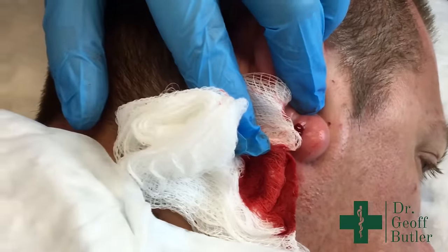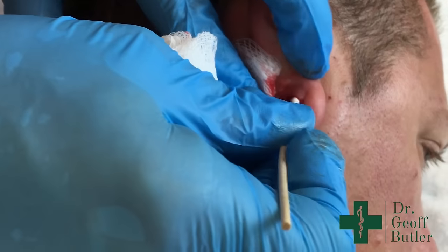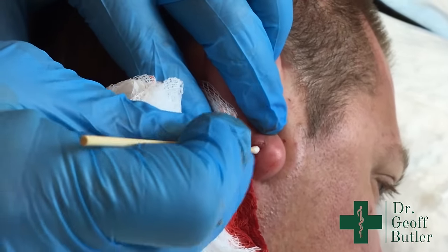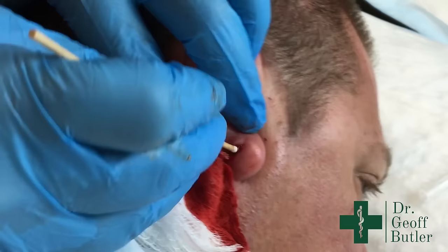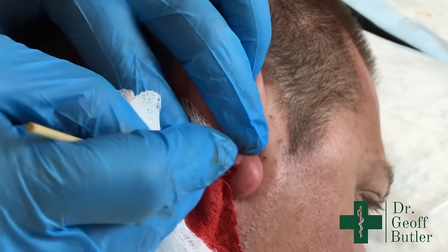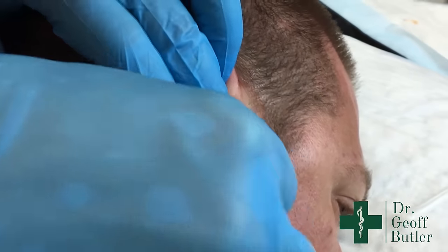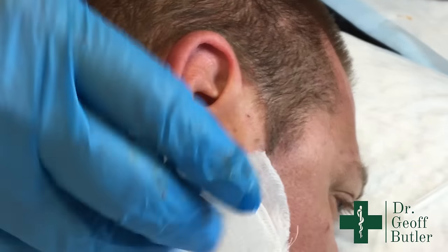I'm going to use a Q-tip to clean that out, and then we'll send away a swab. Avoid the tendency to swab the purulent material that comes out — that's just dead cells and won't give you much of a culture. Properly, you should clean it out before swabbing. As physicians, we're probably not the best at this and are likely sending away samples that could be done better.